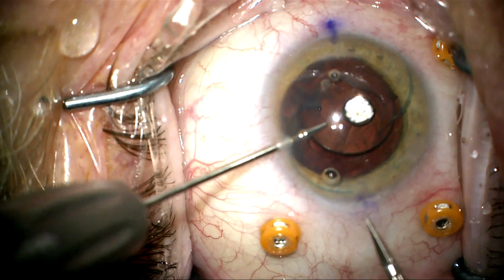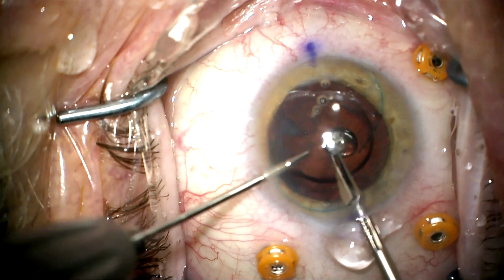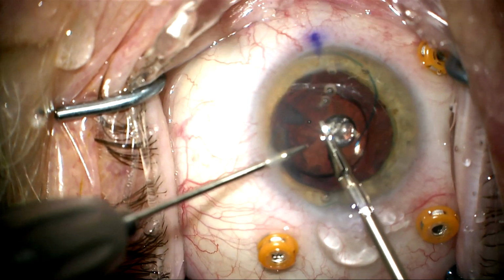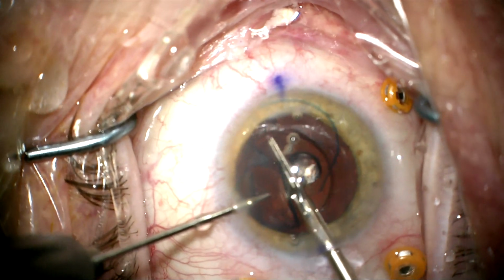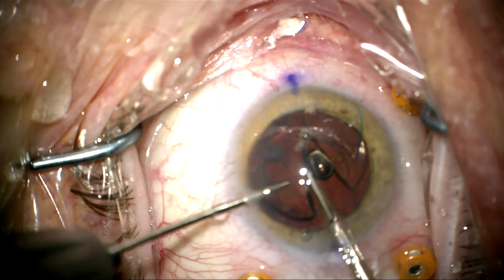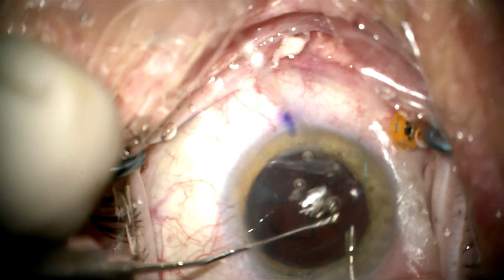We're going to go ahead and cut this silicone lens in half. And this lens, it's very soft, cuts very easily. And we'll pull each lens half out.